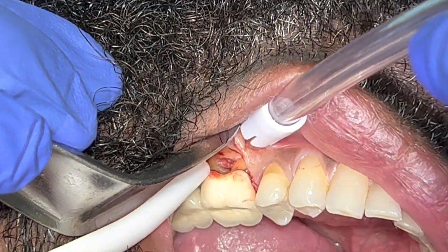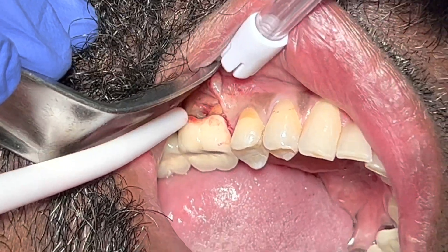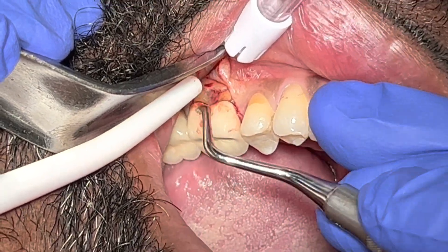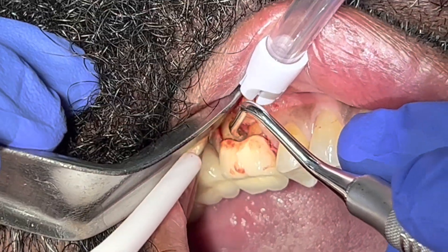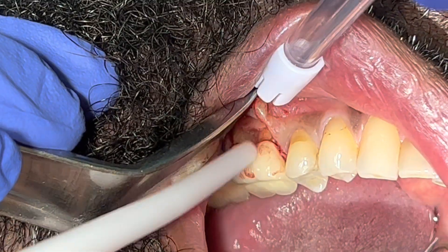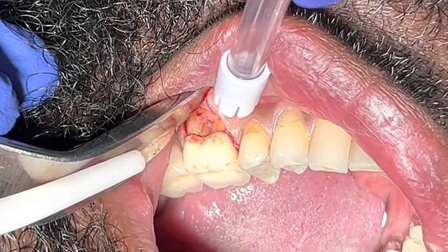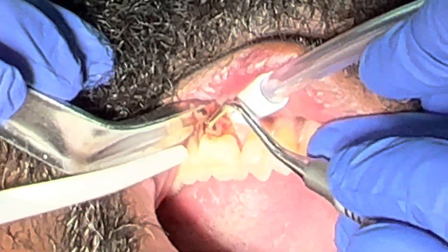So I've flapped it open now. What I'll do is remove all the granulation tissue with the curette at the furcation area. It seems that the way the previous dentist placed the crown gingival margin may have caused a violation of biological width, causing the bone loss.